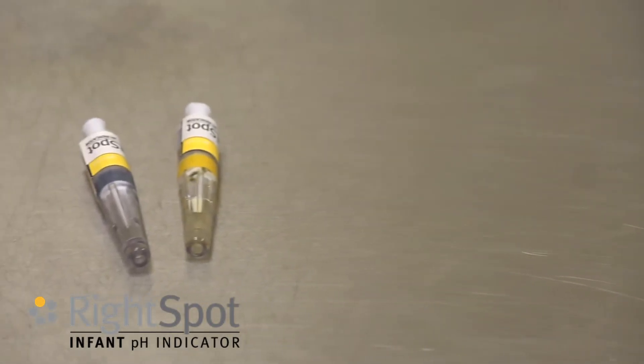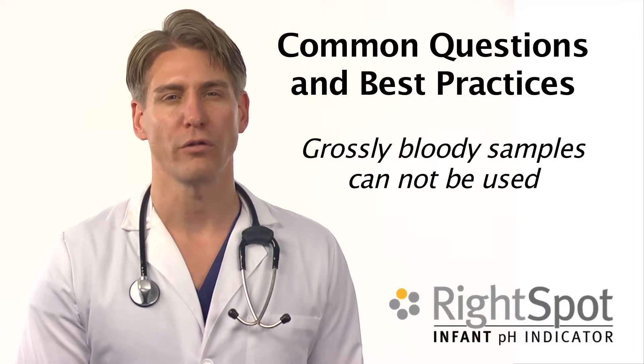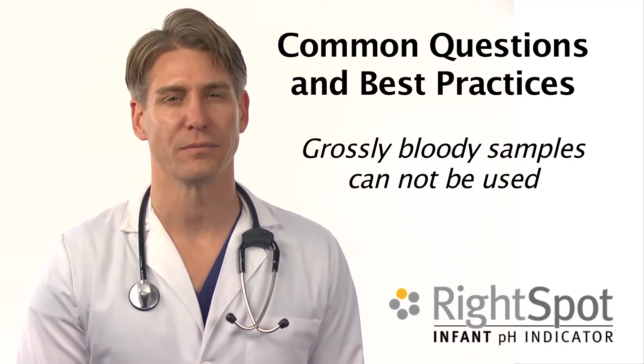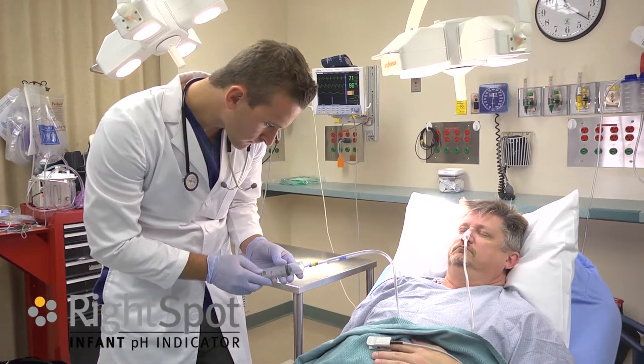The specimen is estimated to be stable for 2 to 5 minutes at room temperature. Grossly bloody samples cannot be used. Specimens with coffee ground emesis can be used.